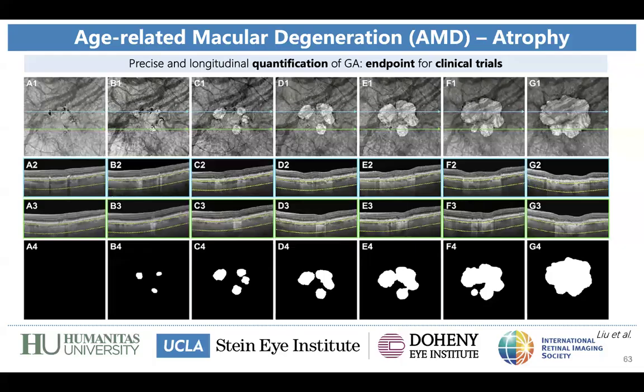And this is important in the context of drusen. For example, calcified drusen, I showed you that they can have a donut pattern, but when they become atrophic, they become a very round hyperreflective and hypertransmission defect. In this case, there was a donut lesion corresponding to a calcified drusen in the past, but now we are only visualizing the atrophy.